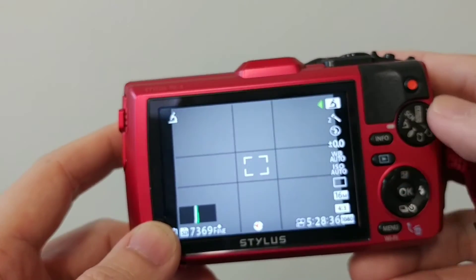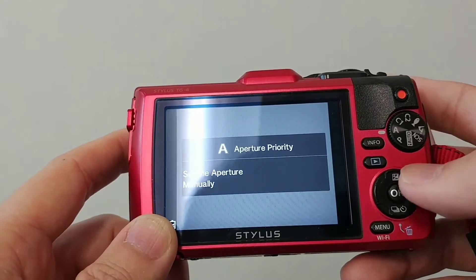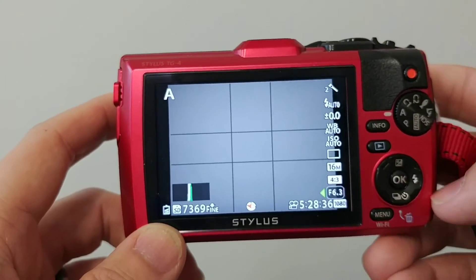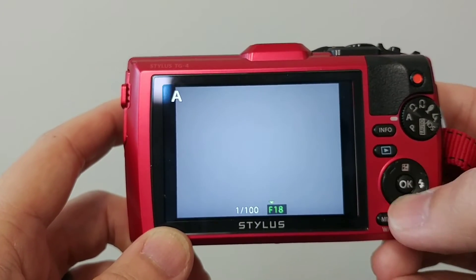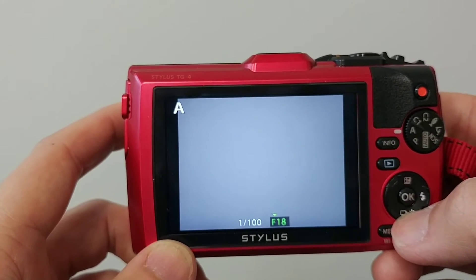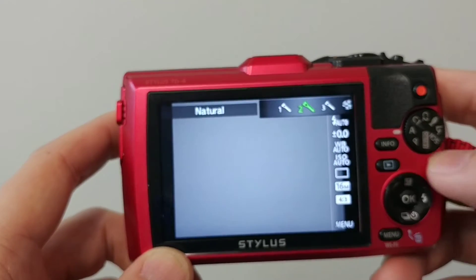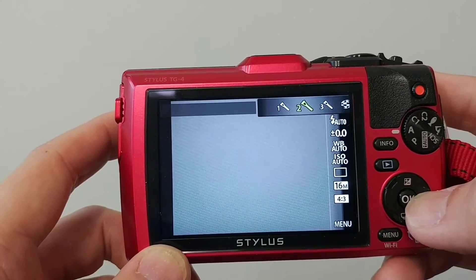I've modified mine a little to work better with dental photography. We start by going into the mode here, then hit the left button, and I set the aperture up to f/6.3. f/18 is unnecessary — that's for the microscope mode. Then hit okay, and use the cursor pad to navigate up.